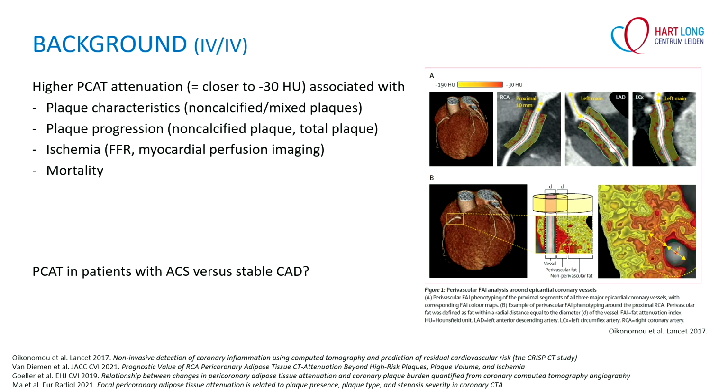And we didn't have what you have now, where you can do an exercise test, etc. So we did it with the CT. And with that one, when we put these patients in, I saw for the first time that really these non-calcified plaques in those patients that were positive were extreme. There was almost hardly any calcium when they came in very young.